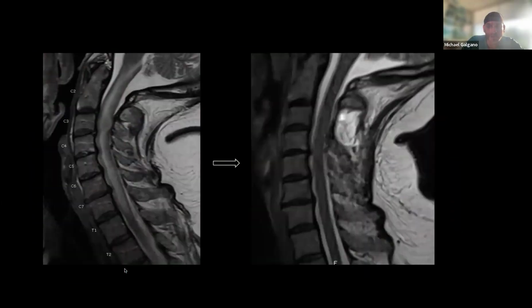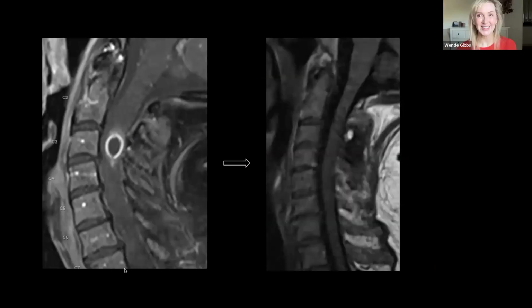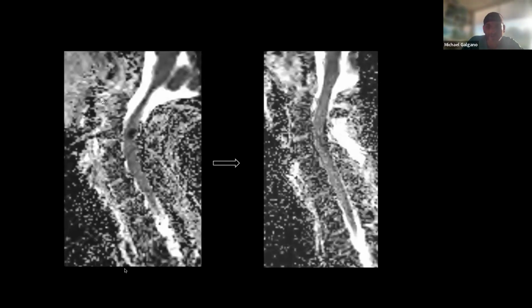And this patient actually did phenomenal. Just drain it and sew him up? Yeah, we drained it. Closed her dura. She went on antibiotics, and she regained all of her strength back on her right side. She actually had right side hemiparesis. This was her follow-up scan, completely gone.